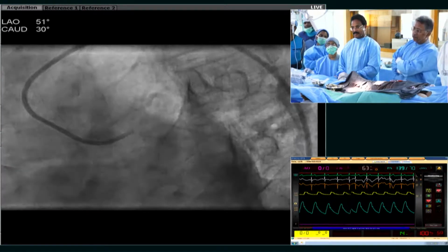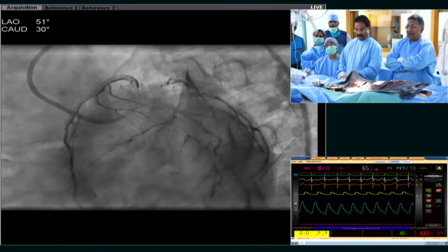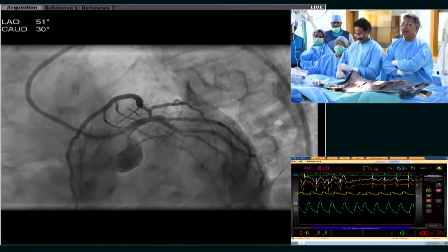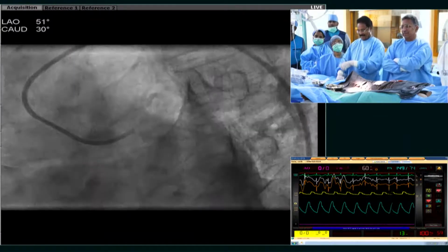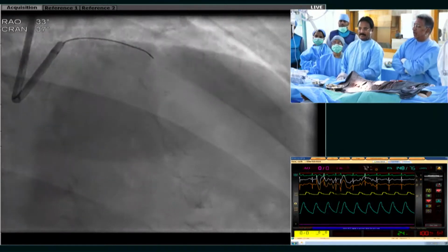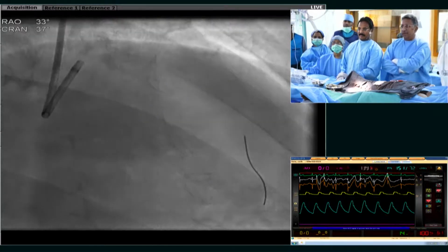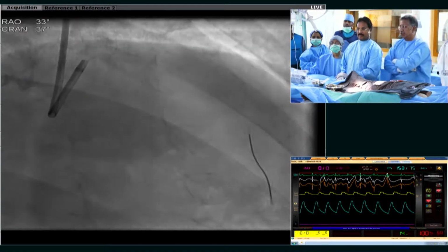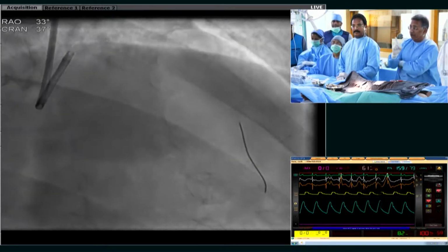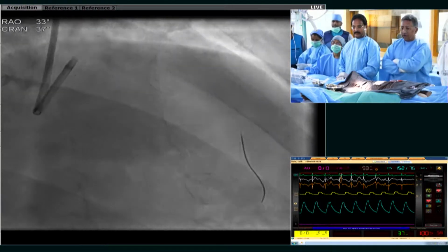So I think let's go to the first part of what we did. We decided to do a physiological assessment because we knew that there would be doubting Thomases. So go to the next view. What we are going to show you is a resting full cycle ratio, what's called RFR, by St. Jude's. So we did that, and we did not give adenosine here. Now, can we have a look at that RFR? Can you show us the RFR on the main screen, please?